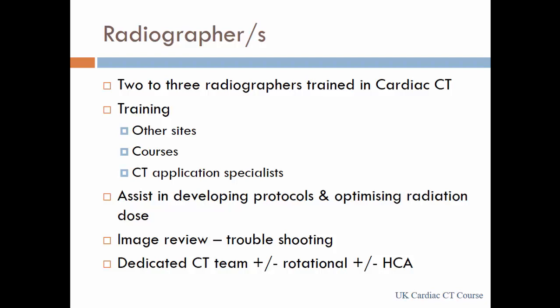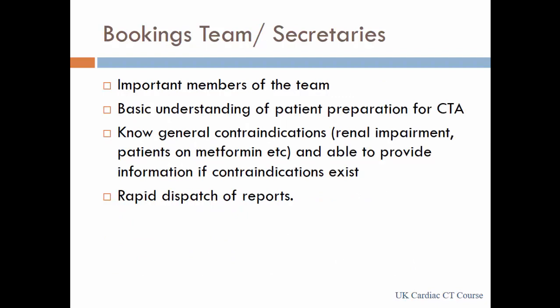So they should be able to review the image as soon as it is produced and troubleshoot if there is any ECG editing to be done. If something has been cut off from the top or bottom of the heart, for example, they need to be able to check it and come and show us what's happening, so that we can review if the scan has to be repeated at the same time before the patient leaves. So teamwork with the radiographers is very, very important for this service.